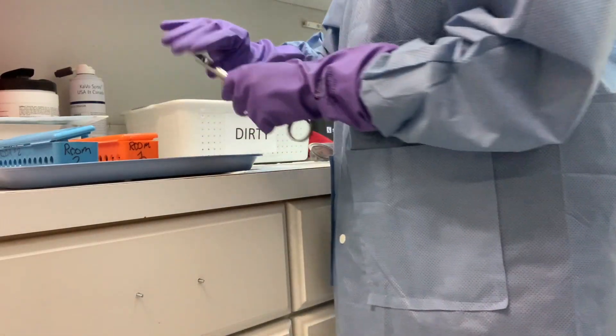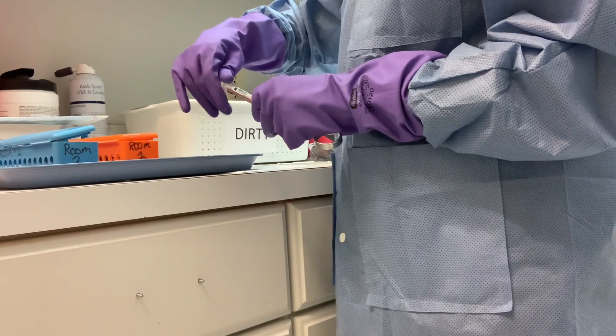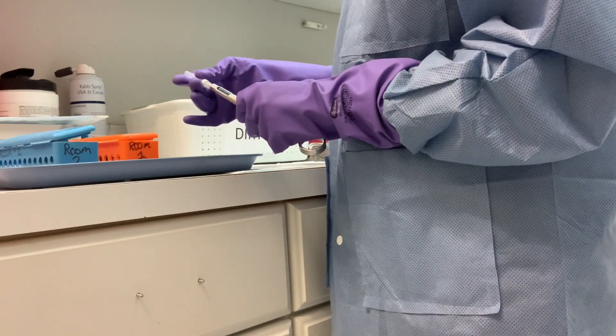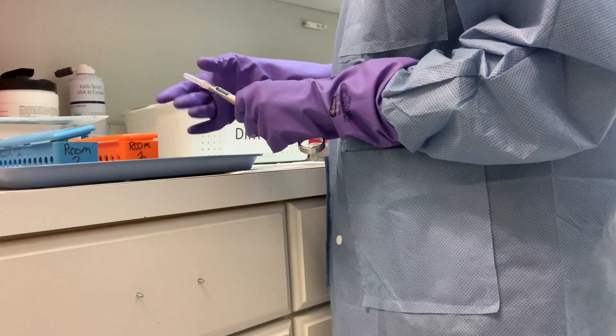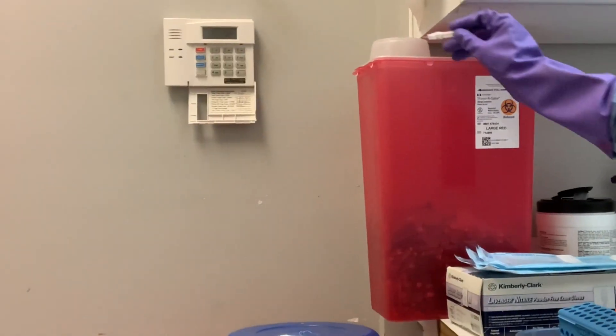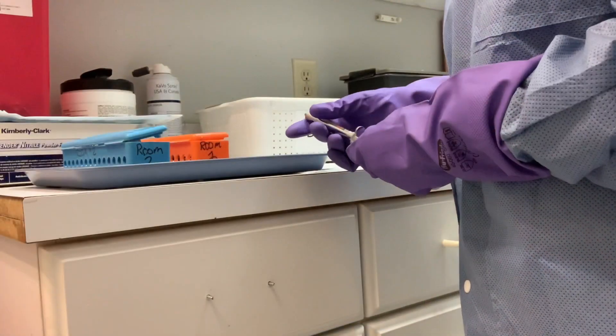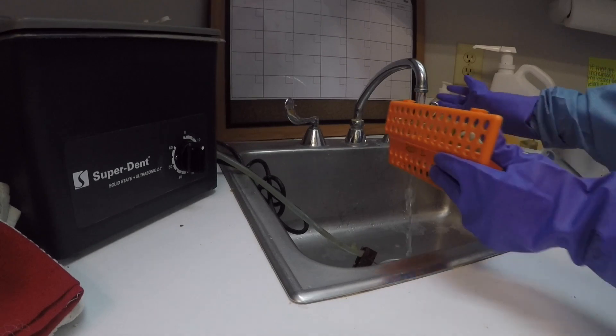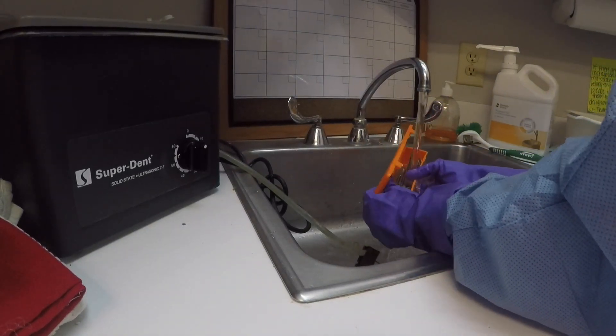I start by removing all the sharps from the tray. You will remove the needle and the anesthetic carpule from the syringe and dispose of it into the sharps container. When the sharps container gets filled, the services come and replace it for you. Sharp containers should be kept at each operatory as well. Now wash your instruments under running water to remove any excessive fluids.